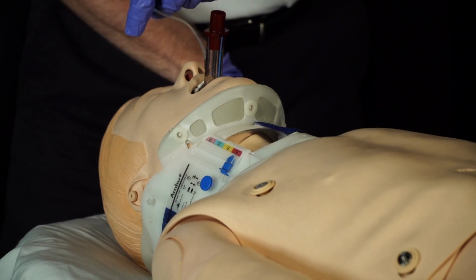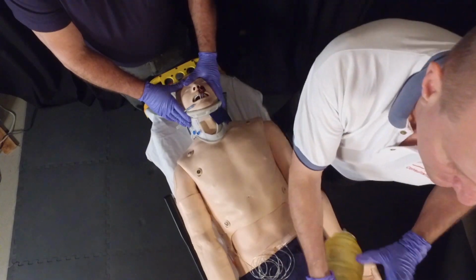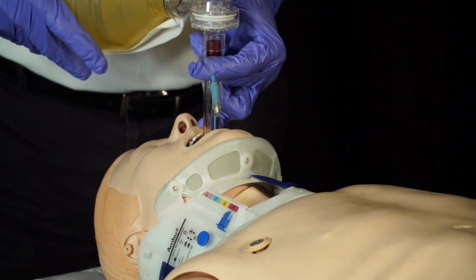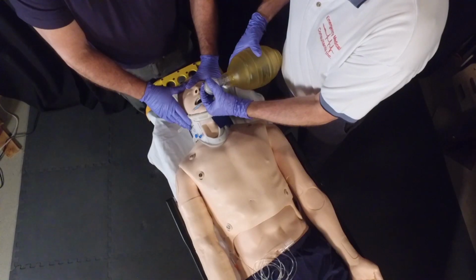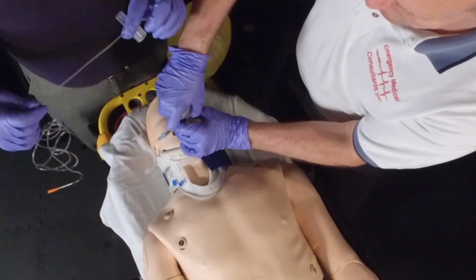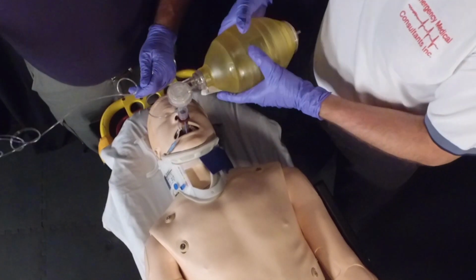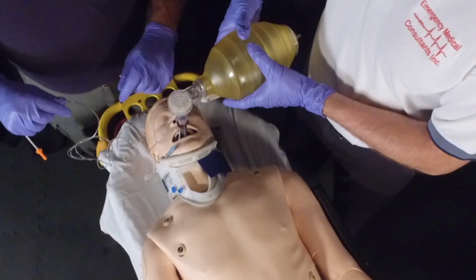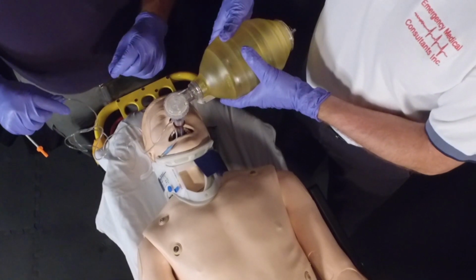The secret to this device is as you ventilate, you must pull back on the tube in order to have the device seat. Sometimes this seems counterintuitive to what we've been trained in, but the device needs to be pulled back. I've seen an inch and a half sometimes in order to get the device to seat. Remember that with either device, you can evaluate end-tidal CO2 just as you would with a tracheal tube. The studies say that they haven't fully evaluated this. However, you should get an end-tidal CO2 reading with any of the paralaryngeal devices you ventilate with as well.